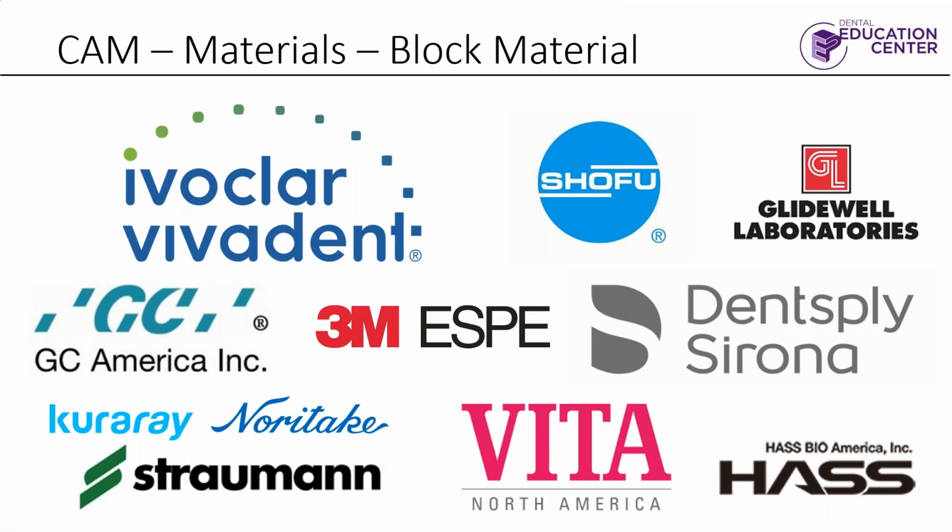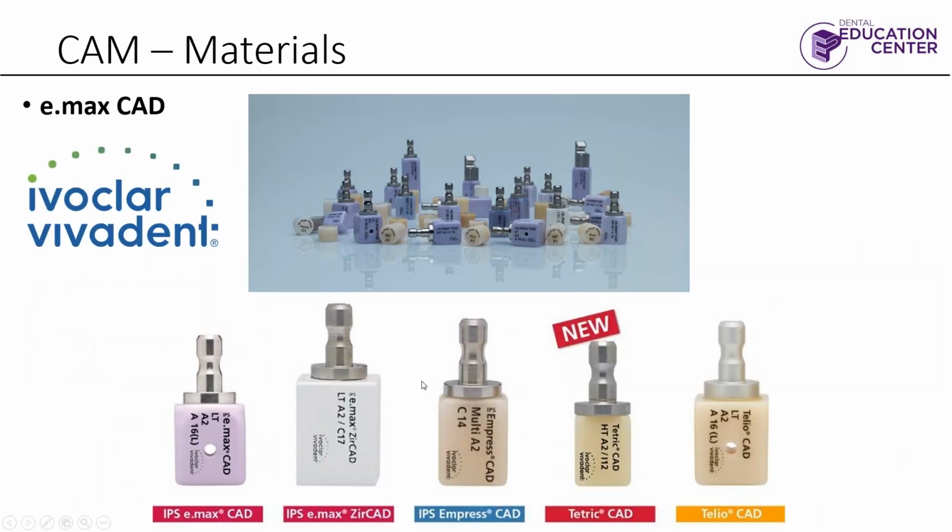Block materials, holy moly. These are all the manufacturers that do block materials, and that's why it's important that you have a mill that can do it. Some of these aren't available in a lot of the systems, but these are some of the manufacturers that actually produce blocks. There's a lot of them out there. Ivoclar. The funny thing about CEREC is you can't drill a hole. That's why there's a hole in there for implants. I always thought that was funny. I loved adding this as part of the lecture.